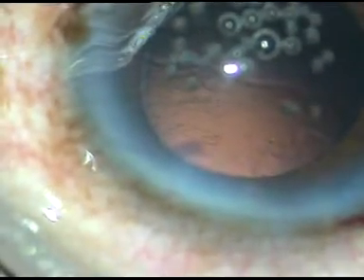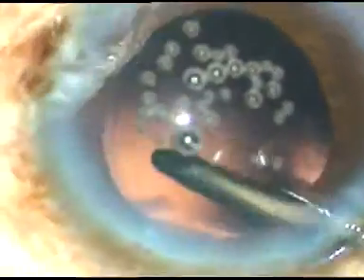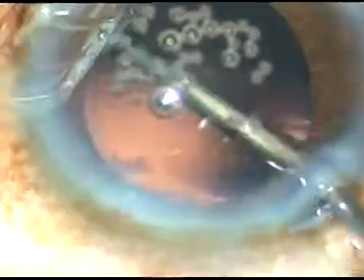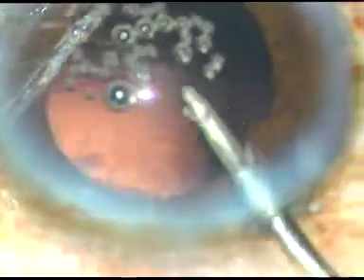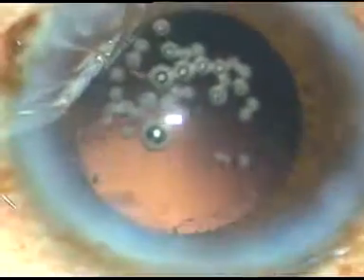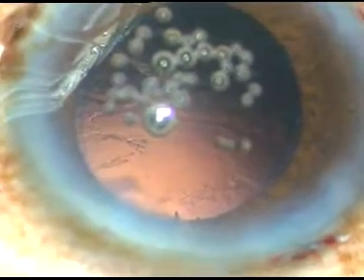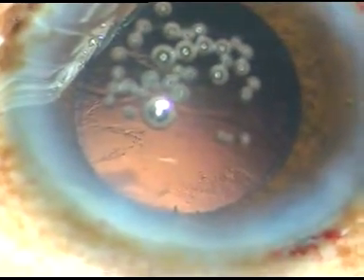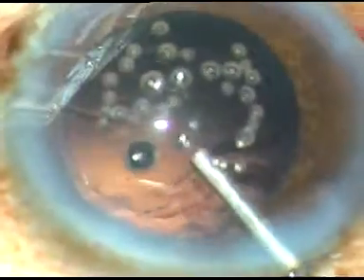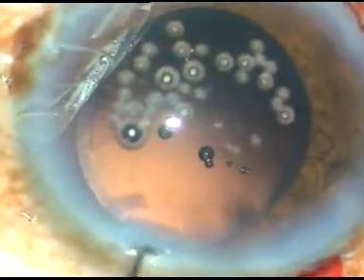There are a lot of cells on the posterior capsule in this case, so I am doing hydro-polishing. The fluid jet of the irrigating probe or bimanual IA is being directed towards the posterior capsule. It is swept over the posterior capsule without touching it and these cells get dislodged. You can also see some fibers sticking to the anterior capsular rim which I have planned to remove later.